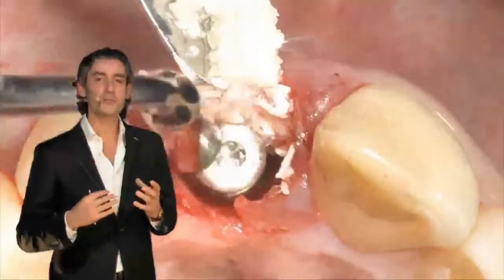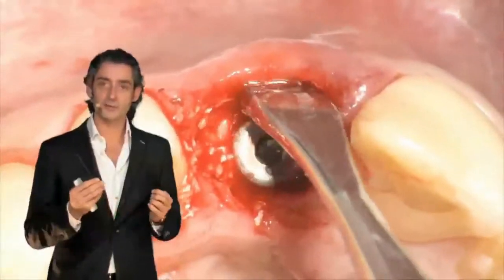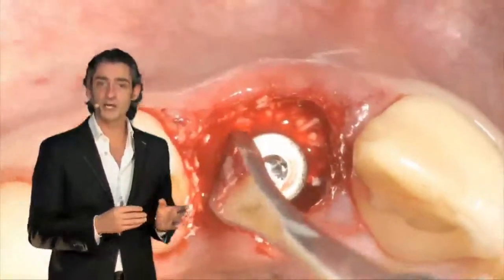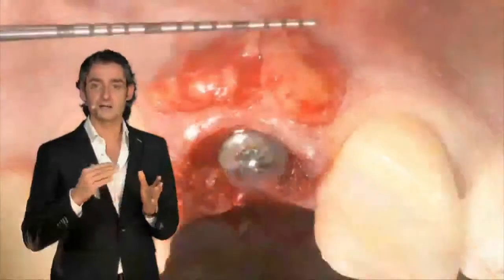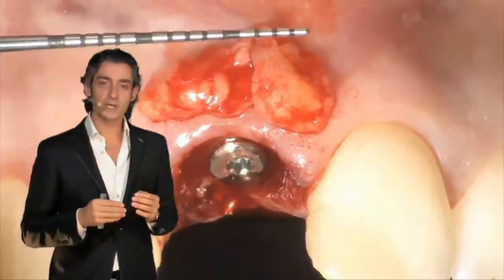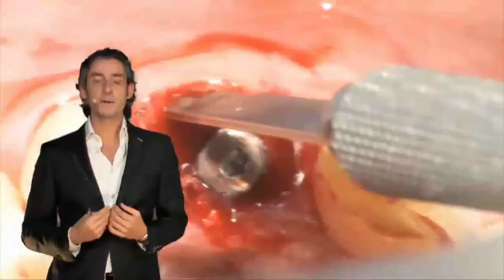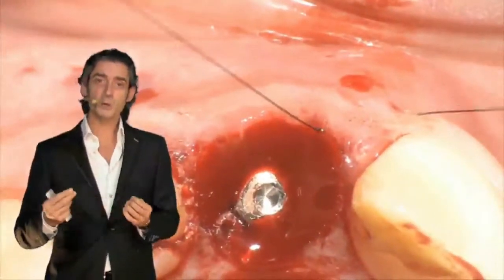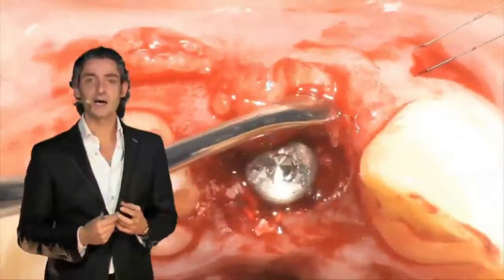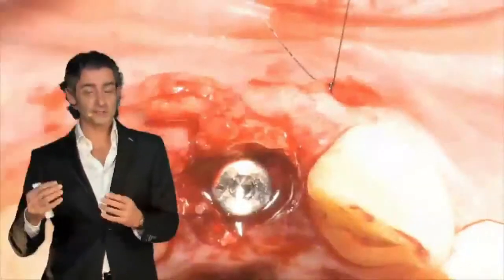But what can we do to maintain the level? For example, we can add in the beginning some connective tissue graft. And the connective tissue graft can come, for example, from the palatal side or from the tuberosity, and we can make this connective tissue graft with a tunnel procedure. And as you can see here, we can make the tunnel in the distal, in the mesial part. Sometimes we can pass also in the buccal side, just taking care to avoid fenestration of the tissue, and we can fish our tissue inside this tunnel. And with only 2 sutures, we are able to fix our graft.